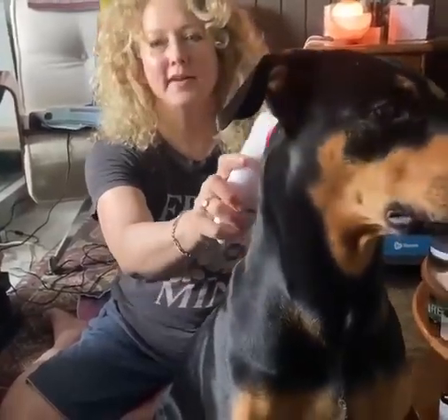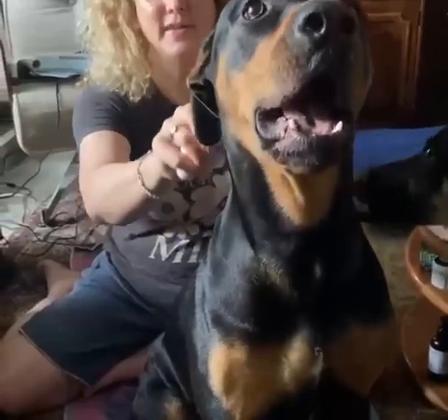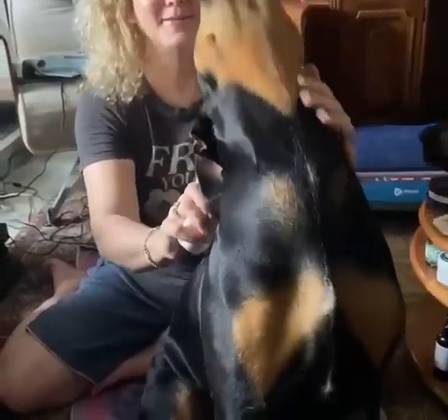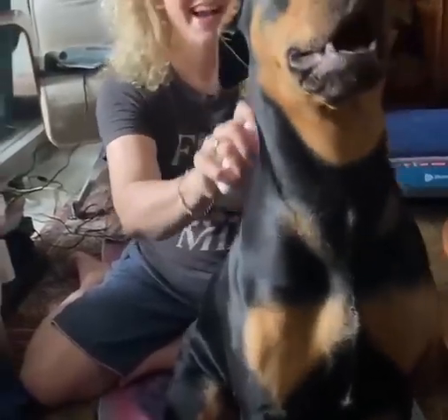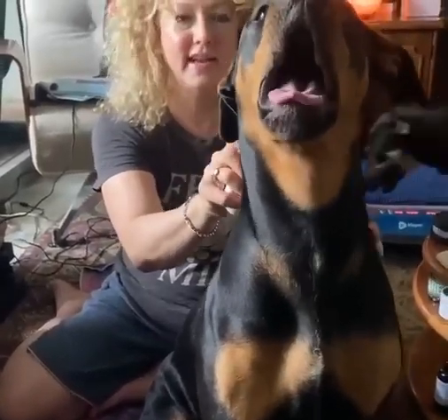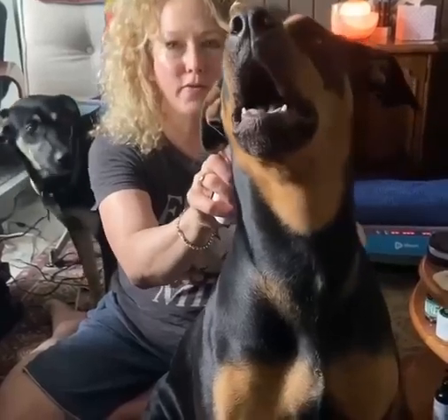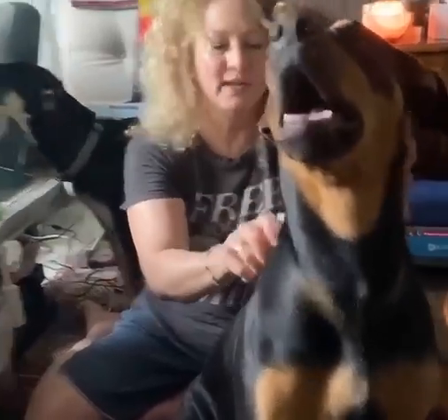Hi, I'm Suzanne O'Brien with PeerTumple.org. I do rehabilitative canine animal massage therapy. I wanted to talk about the Domer Laser today. I've been using it in my practice for about three and a half years. Really love the device.